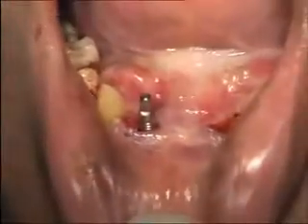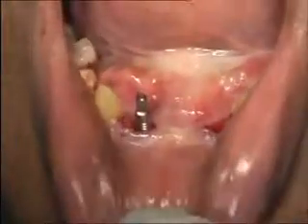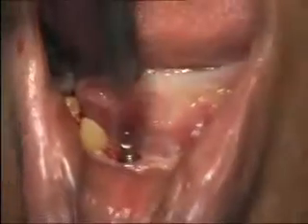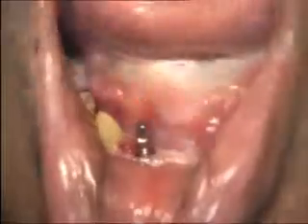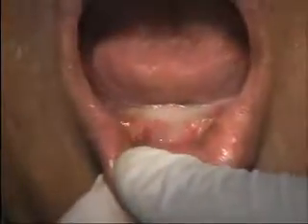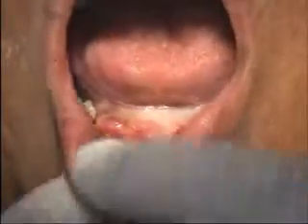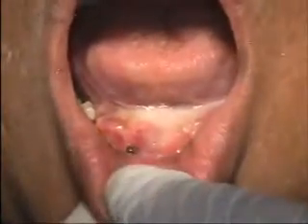Take a mirror handle please. Don't move. Can you hear? It should not be a dead sound as when I hit on rubber — it should be this metallic sound. This tells me the integrity of this implant is phenomenal. This is going to support, even if it is through the weak. This is ready for immediate loading.